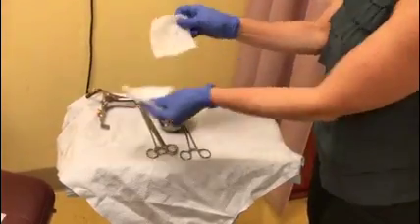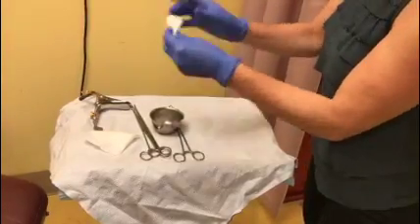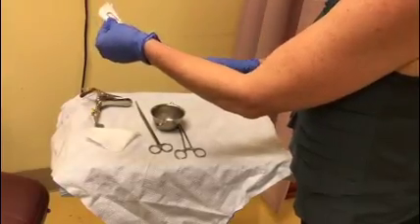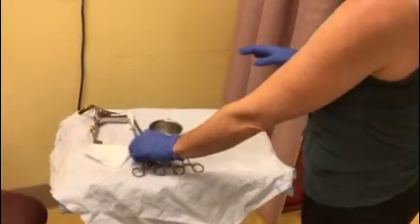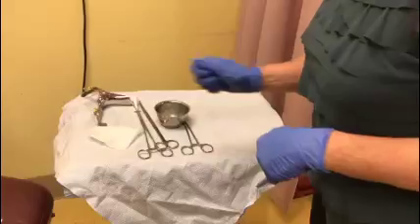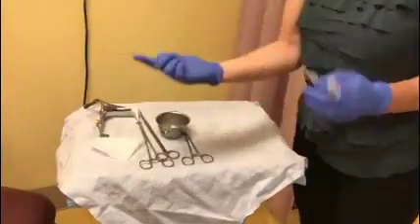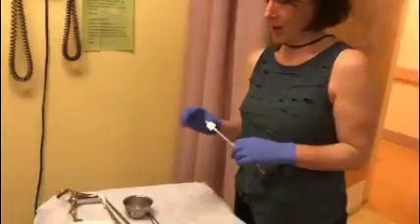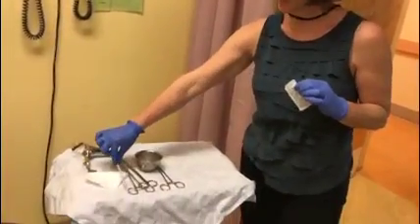I take out the gauze — just one piece — fold it into four parts, and put it on my ring forceps. I'm going to use that to gently wipe the cervix, but I don't want it too big as to irritate the vagina. I put some iodine on that to wipe the cervix. I'll get some gel in the corner of my tray — I'll use that both for my finger during the bimanual exam and for the speculum. If I'm collecting a pap or getting a gonorrhea or chlamydia probe, any of that I can put on the clean side of my tray.